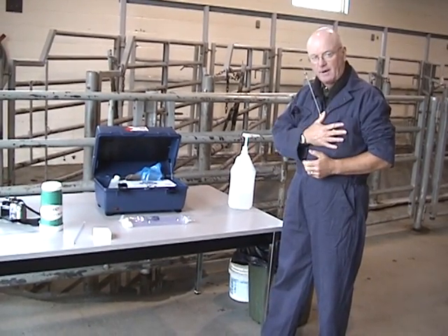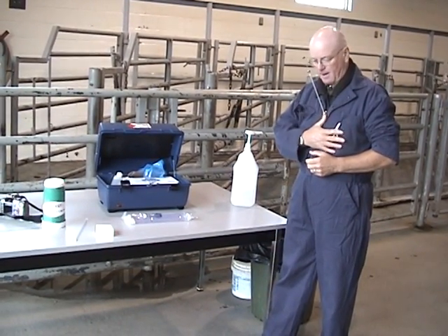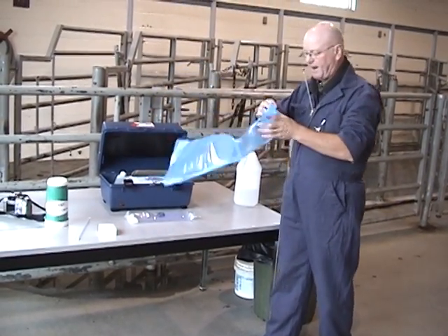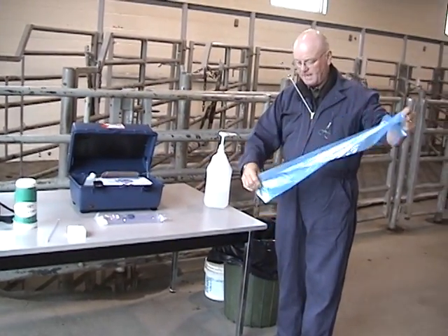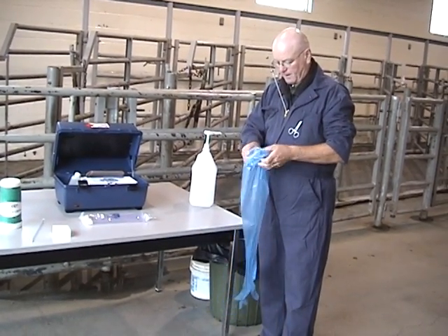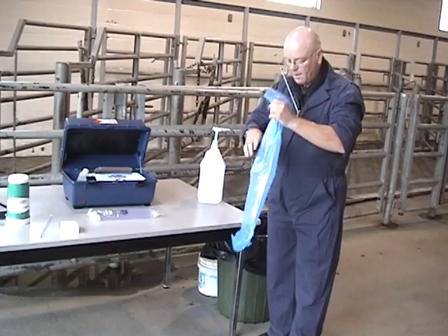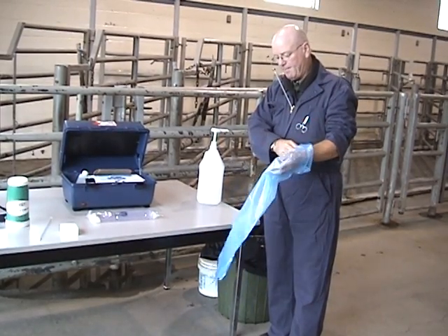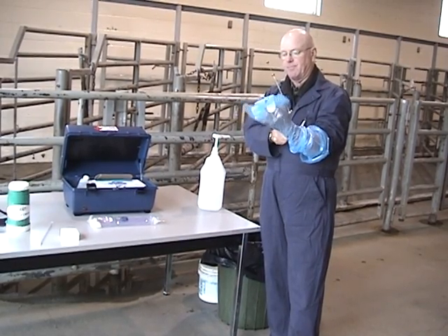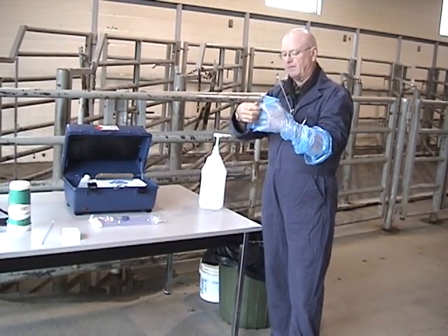We've got our gun loaded and protected within my coveralls. We're now going to get ready for entering the cow. We're going to take a disposable plastic sleeve. I'm pointing to the cow with my left hand, so I'm going to put the glove on my left hand.